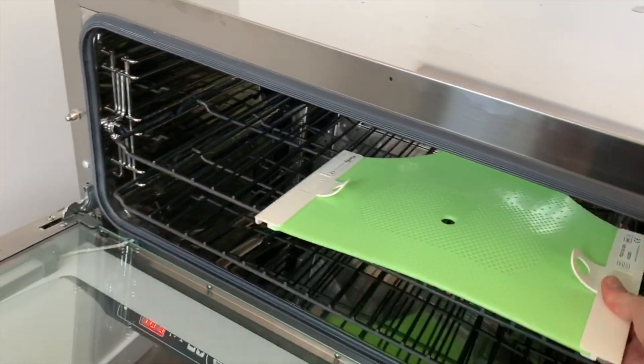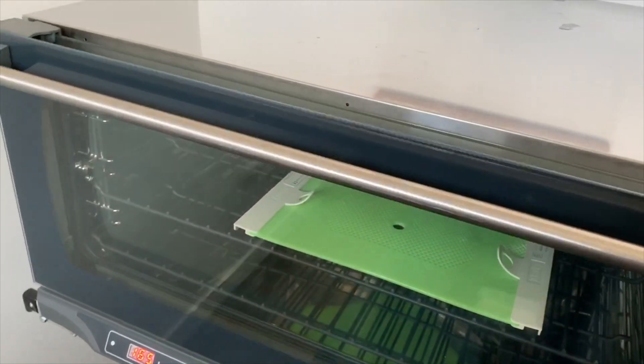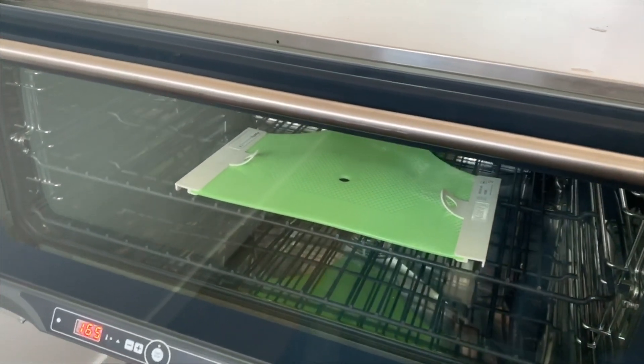The mask should be ready in about 2-3 minutes, and the easy viewing glass door will aid in seeing when the thermoplastic is slightly transparent.